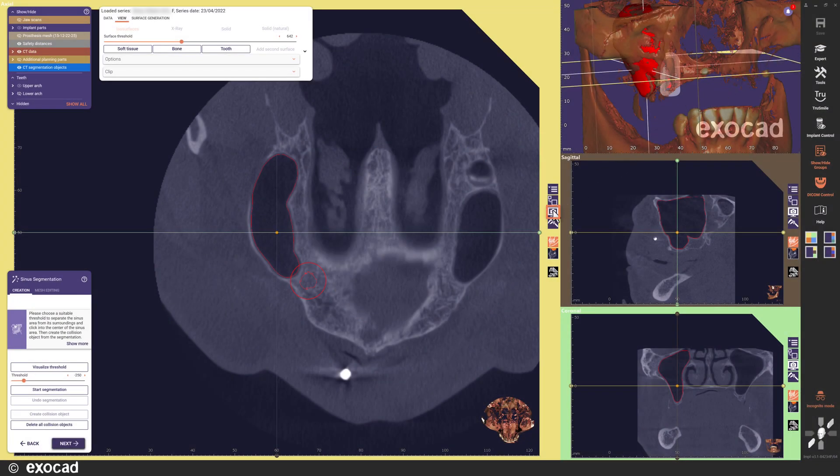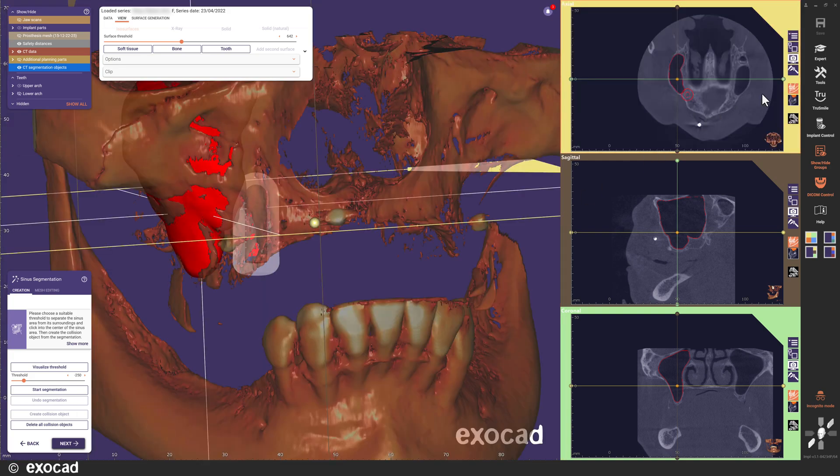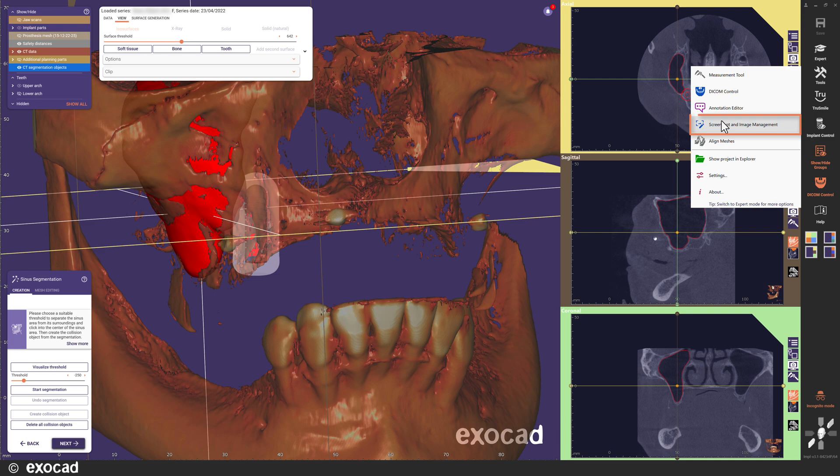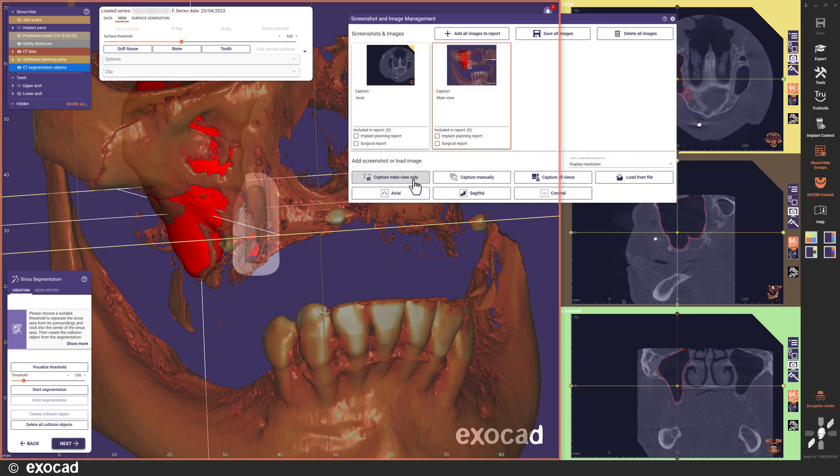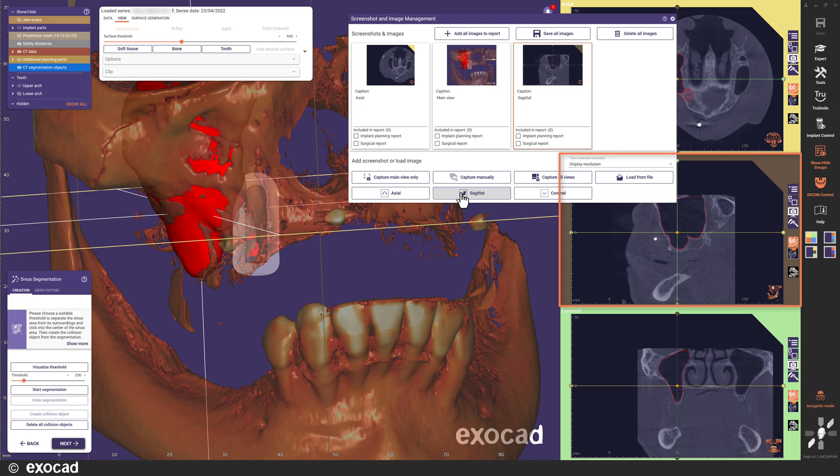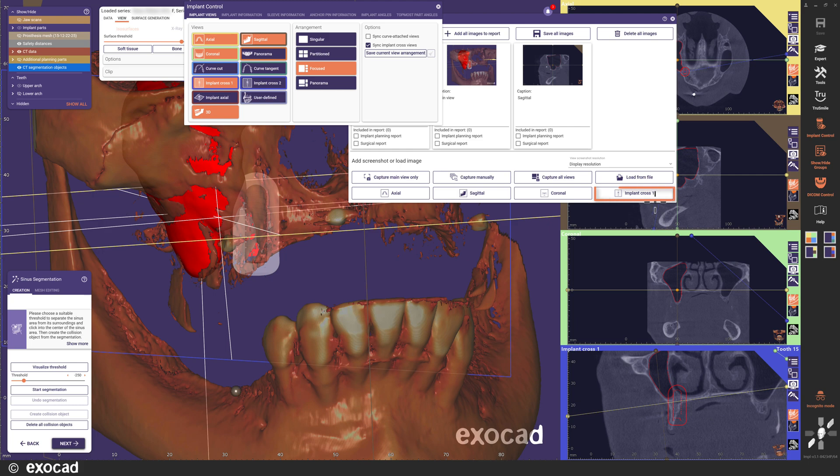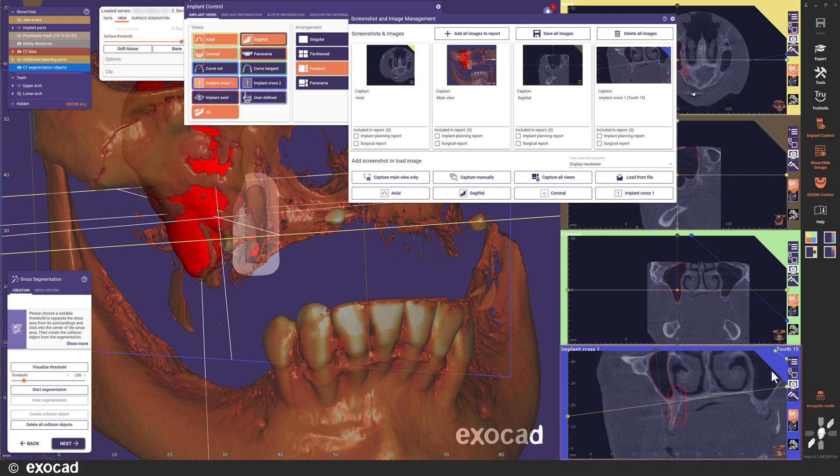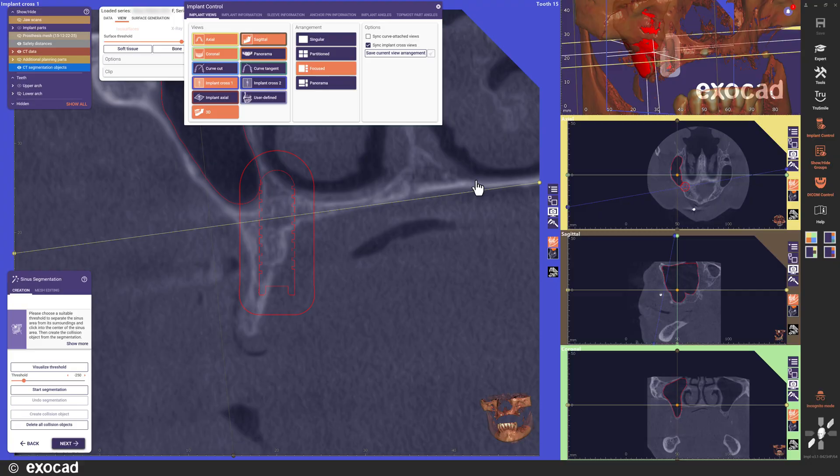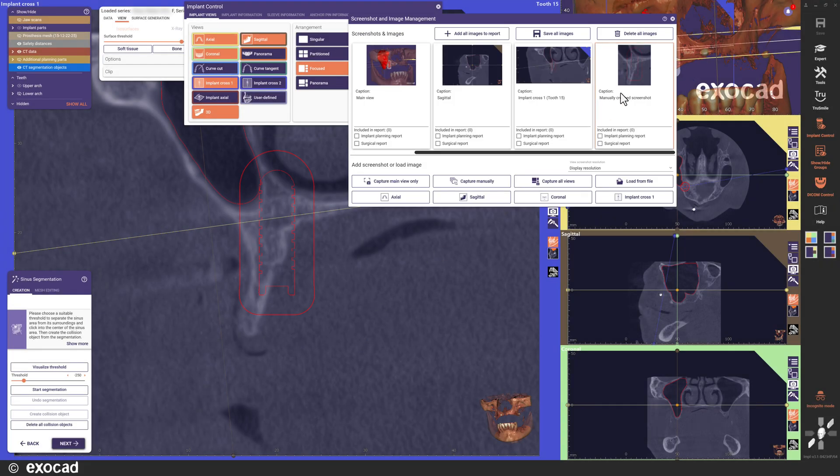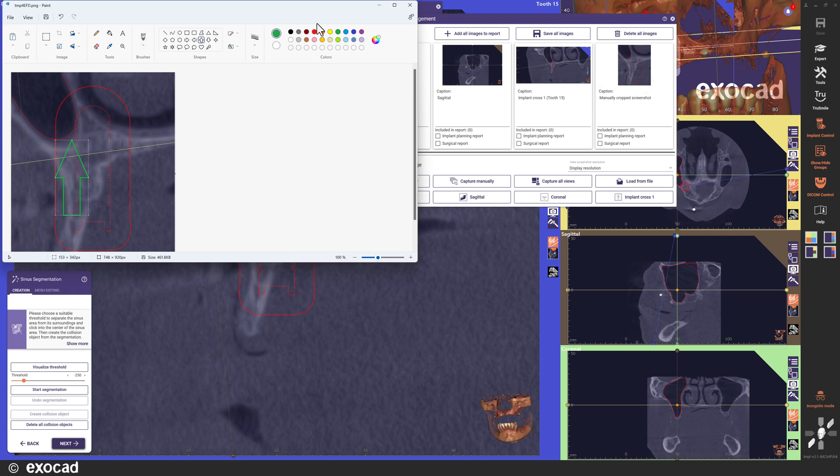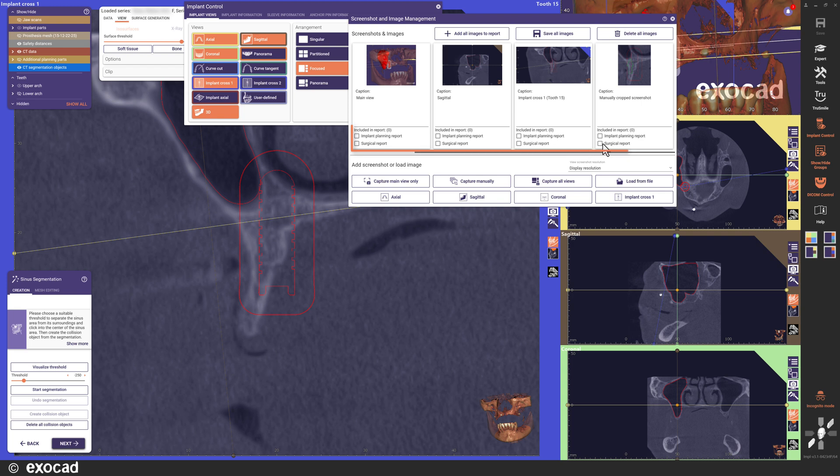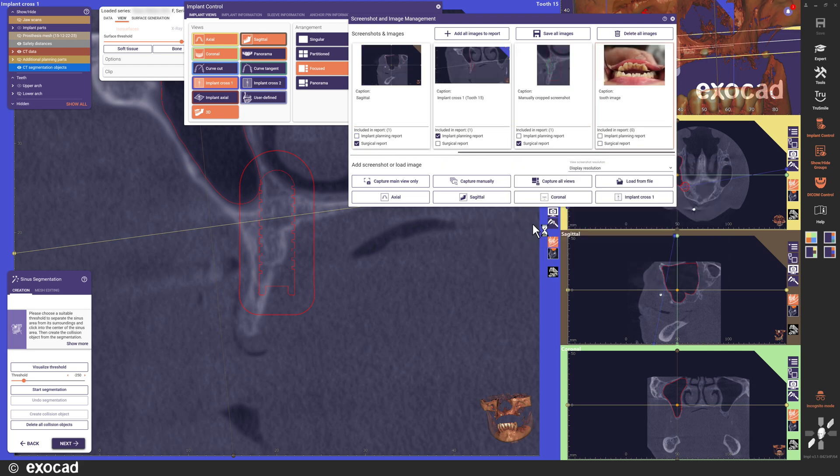That you can now do easily with the new screenshot and image management tool. Use the screenshot button for the view you want to capture. The image is added to the screenshot and image management tool, which can be opened from the tool menu. All open views also have a corresponding button within the management tool, which generates a screenshot of that view. You can also select the screenshot region manually. You can use the edit function to further highlight areas of interest. If you want the screenshots included in the reports, just check the corresponding checkbox. Maybe you have an image saved somewhere else that you want to include in the report. No problem, just upload it using the corresponding button and check the box to add it to the report.